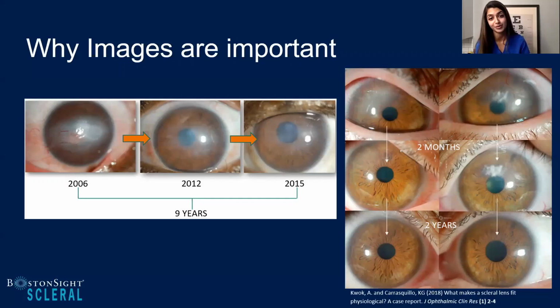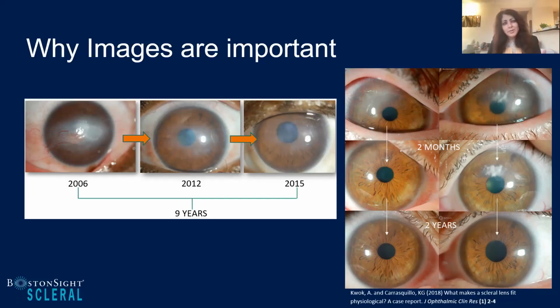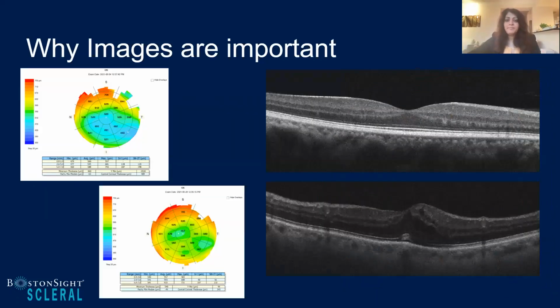And if we didn't have those photos, number one, we wouldn't be able to monitor it, but two, there's such a beautiful wow effect for your patient as well. It makes it so much easier instead of you looking and going, does that look a little bit better? Does it look a little bit worse? Isn't it better? Because we both have had cases of this too, where we have seen improvements of corneal scars with scleral lenses. And I wish I had my camera years and years ago where I could have been able to take these images, but this is beautiful. And this is a prime example of where photography really comes into play.